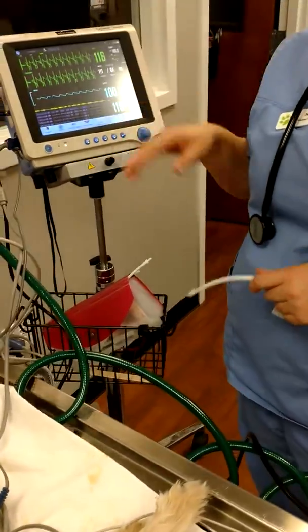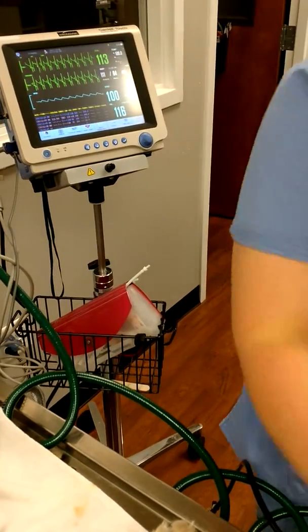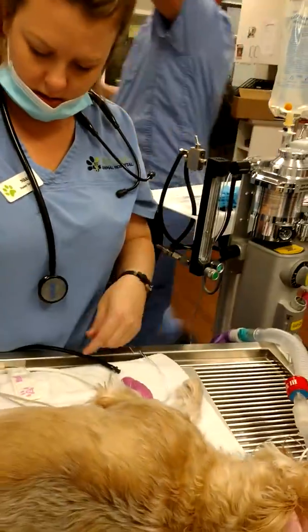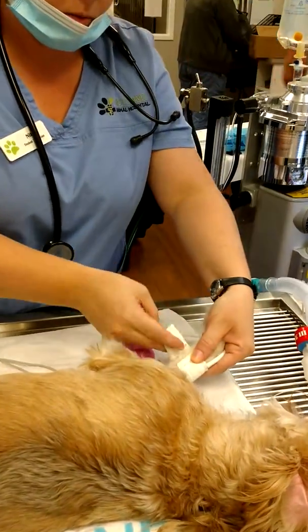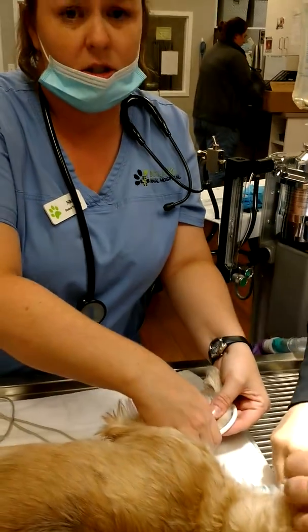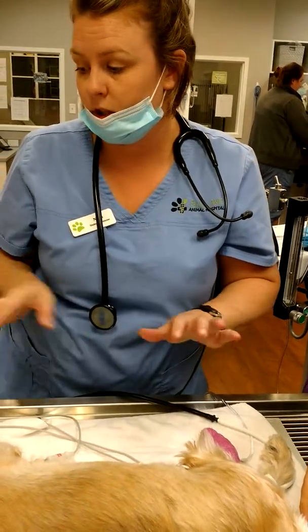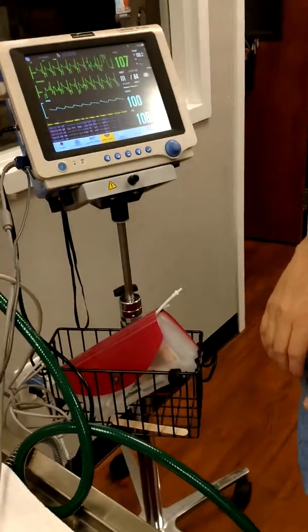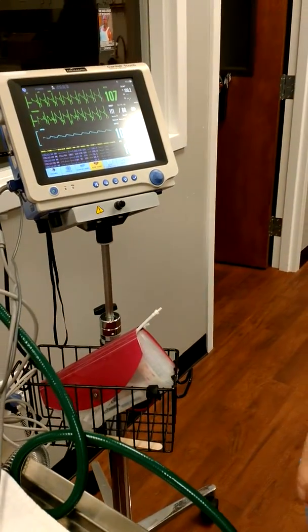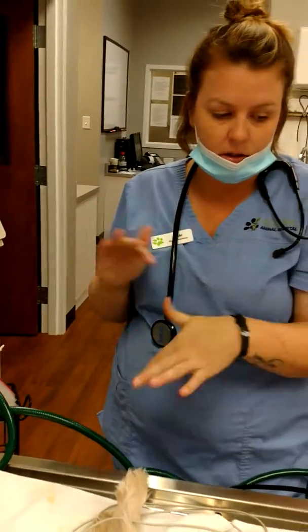I got a normal blood pressure reading. A mean arterial pressure of 86 is normal. I'm going to try a smaller one because the wrap is just too long. It's worth taking the time to get this adjusted first and make sure it's correct, rather than be in the middle of a procedure and question your blood pressure while an emergency might be going on. So I just switched it out — that felt like it was a better fit, wrapping around three quarters of the cuff.